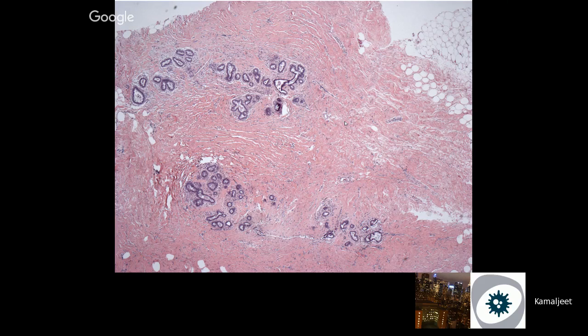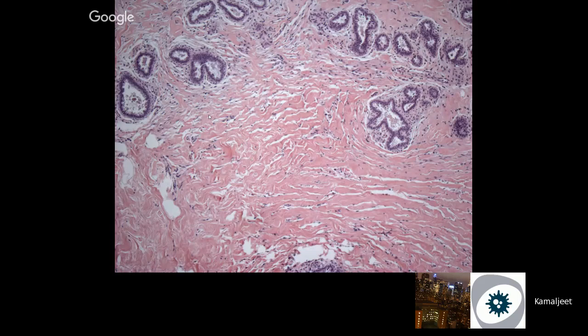PASH: typically the findings are very typical. They look like gynecomastoid, but you have to focus on the stroma. In the stroma, you'll find these pseudovascular spaces with nuclei hanging onto the edge. If you look at PASH under frozen, they're actually supposed to be filled with some matrix mucin, and during processing it gets washed off. So that's PASH. It can come in two flavors. One is this, where it doesn't form a mass and it's just a diffuse, incidental finding. The second is nodular PASH, where the patient will get a targeted biopsy of the mass, which is PASH.